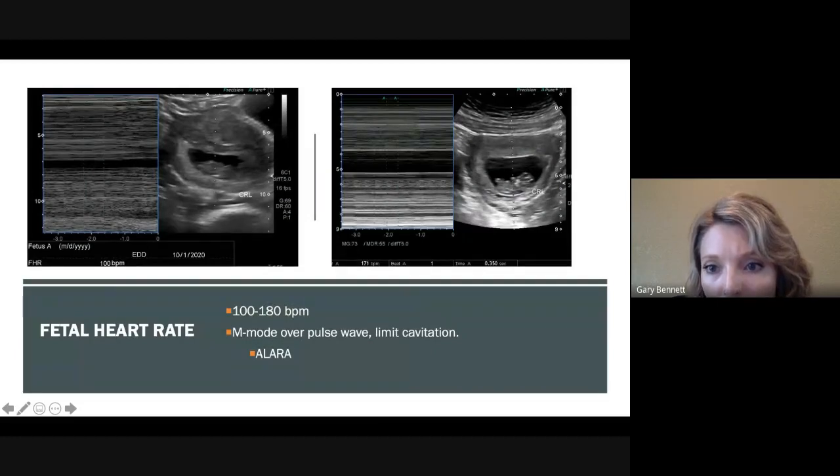And then as we come down, you can see right about there, that's where I'm getting the heart rate. And right here. So it's pulsing right there. So we're going to measure that heart rate. It really doesn't matter where you measure it. Looks like I measured peak to peak here, but as long as you measure the same spot in the cycle, you'll get your heart rate.